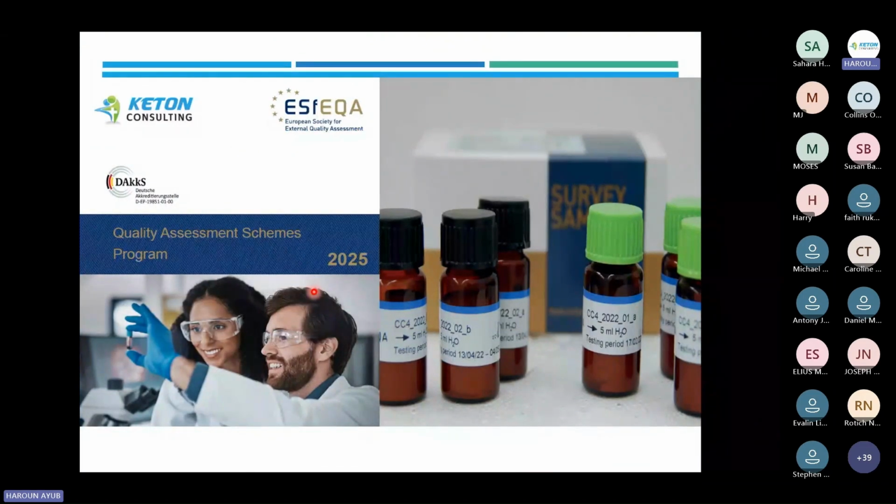You'll get lyophilized or liquid samples. The IFU is very important. Don't run the EQA without reading the IFU. And if you've been running our EQA since 2020, you may have crammed the IFU. Remember, each and every survey, the IFU must be read.